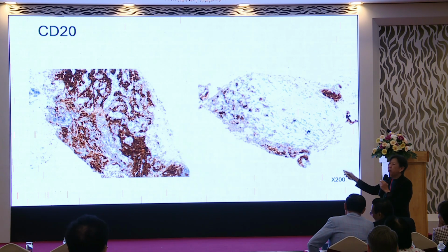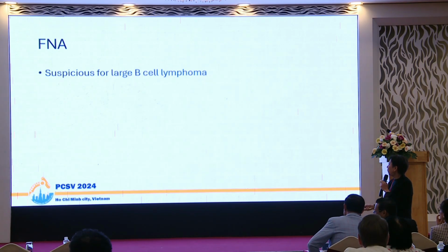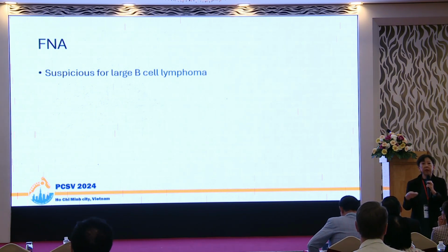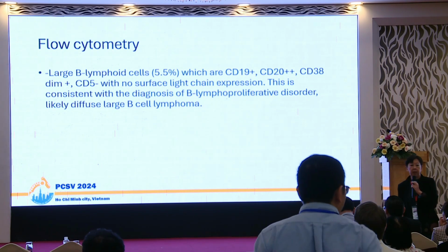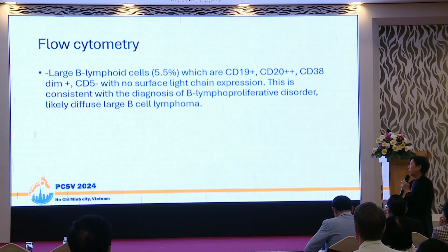On CD20, you can see a lot of handling artifact, but keratin was negative. So she put up a diagnosis of suspicious for, and the recommendation is, if you have any leftover fluid or you pass another one, give it to the hematologist. Please can you do a flow for me? Then everybody is happy. So you have the ancillary test, use it, don't sit and wait.